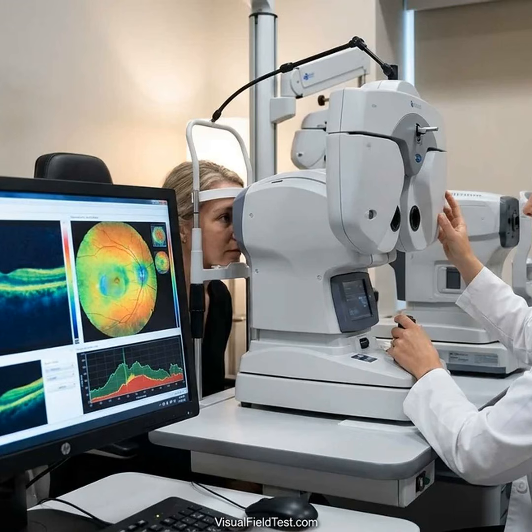Macular, central retina, thickness. Beyond the ganglion cell layer, OCT measures overall macular thickness. Some devices show color maps of the macula. Thinning in parts of the macula may also hint at glaucoma.